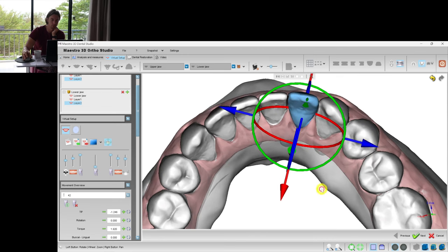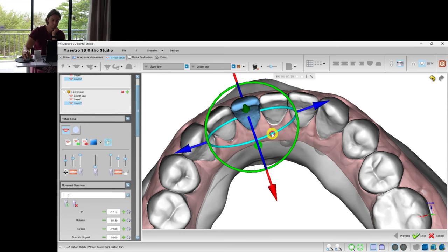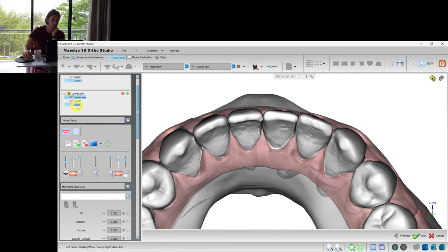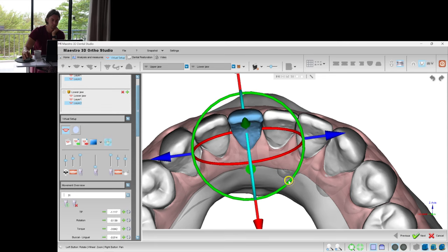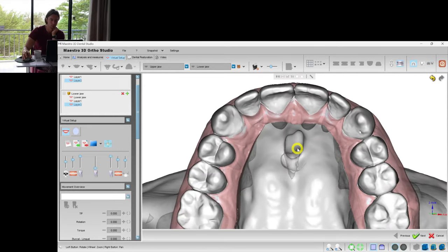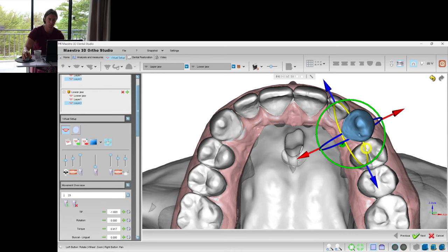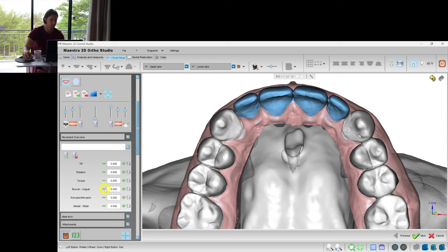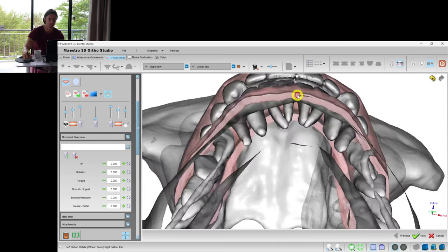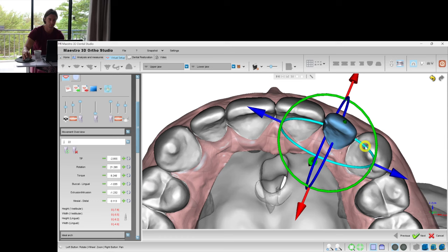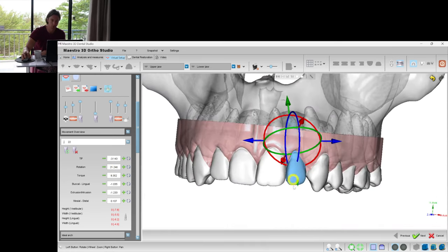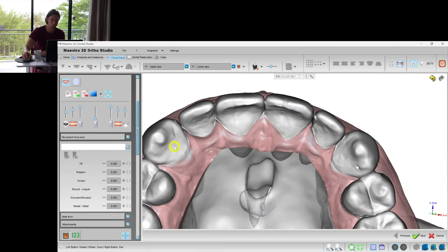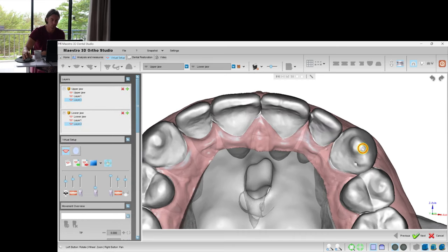Distribute the IPR, distribute the space we got to make the IPR more even between all the surfaces. And I think we can reduce the sagittal gap by placing the incisors more palatally. I am not sure that we will be successful with this rotation because it is quite big for such a small crown. But let's try. Maybe we will put some attachments to have this rotation happen.